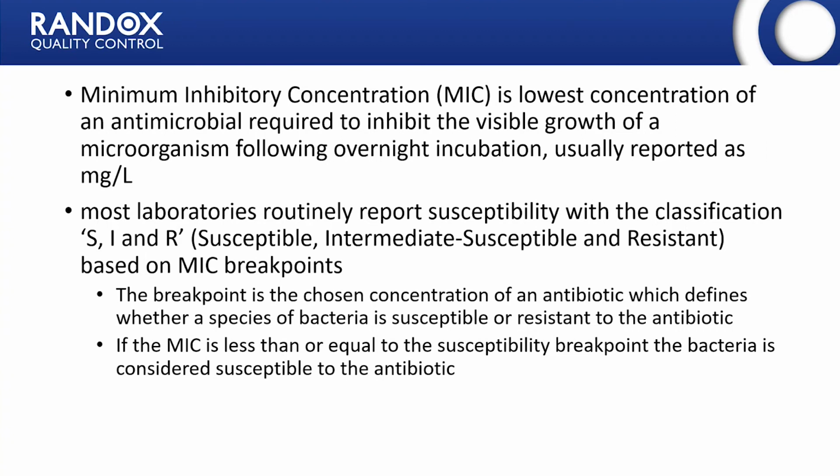So what we're looking at here is this minimum inhibitory concentration, or MIC. We then use that to classify whether a microbe is susceptible, intermediate, or resistant based on these MIC breakpoints.